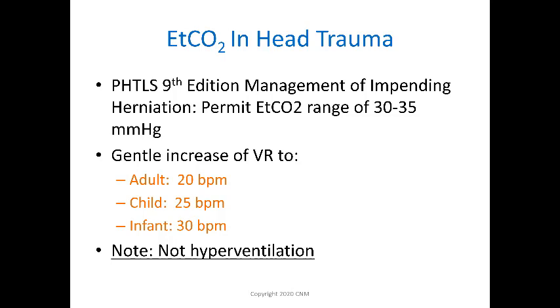So we're going to increase their ventilatory rate and very carefully watch end-tidal CO2. Again, the caution is if this is multi-systems trauma and not an isolated head injury, then we may have some question about the reliability of end-tidal CO2 in the first place. But think smart about it and don't be afraid of the injuries.